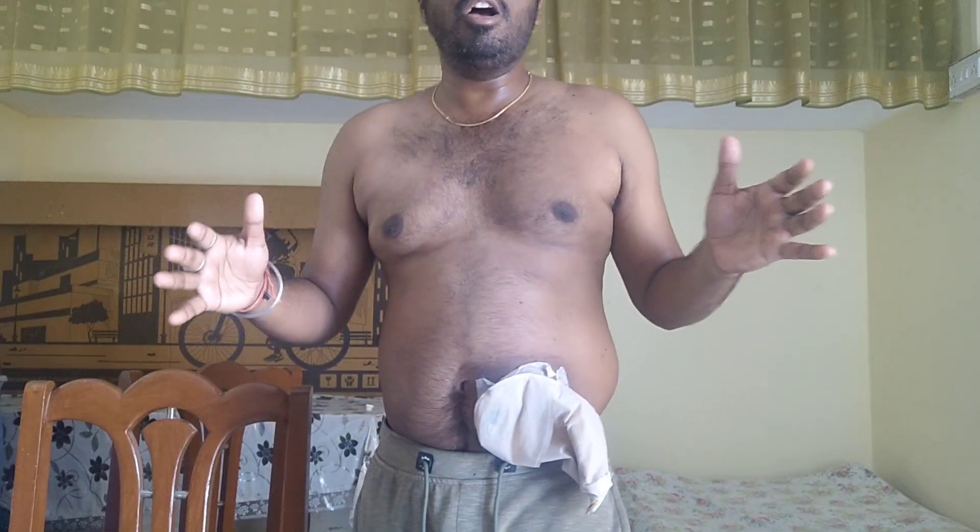A lot of people go to offices and wear very formal kinds of dresses. For them, putting their bag in a vertical position sometimes becomes very difficult because they have to put their shirt inside and do formal dressing. So this is why the horizontal belt is useful.